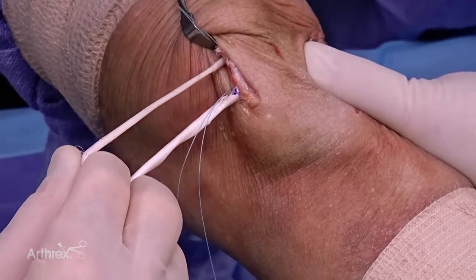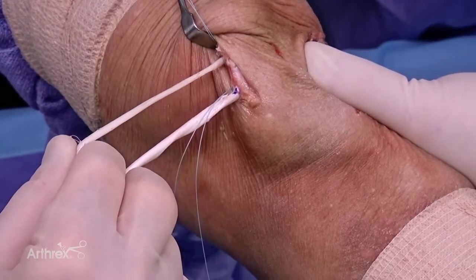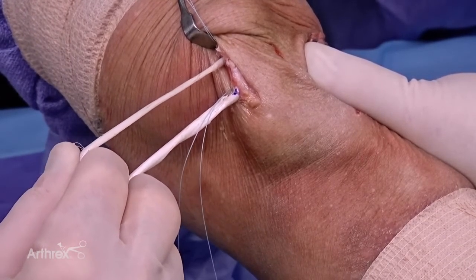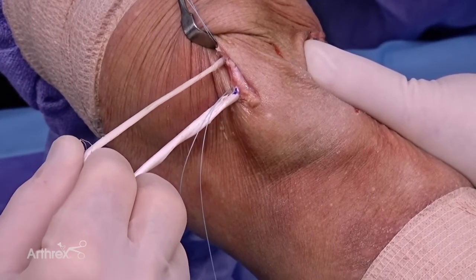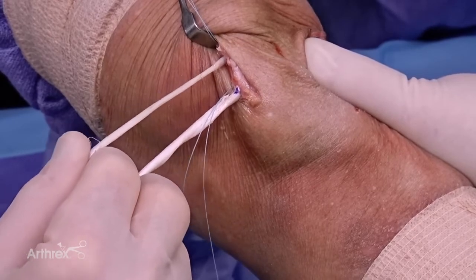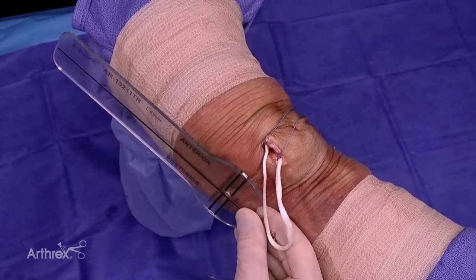I keep these 2-0 wire sutures that are in the anchor because I like to use those sutures to close the medial retinacular tissue later on for a little additional fixation as needed. So I keep those sutures in place for now. Again, great fixation with the 3.9 Swivlock.